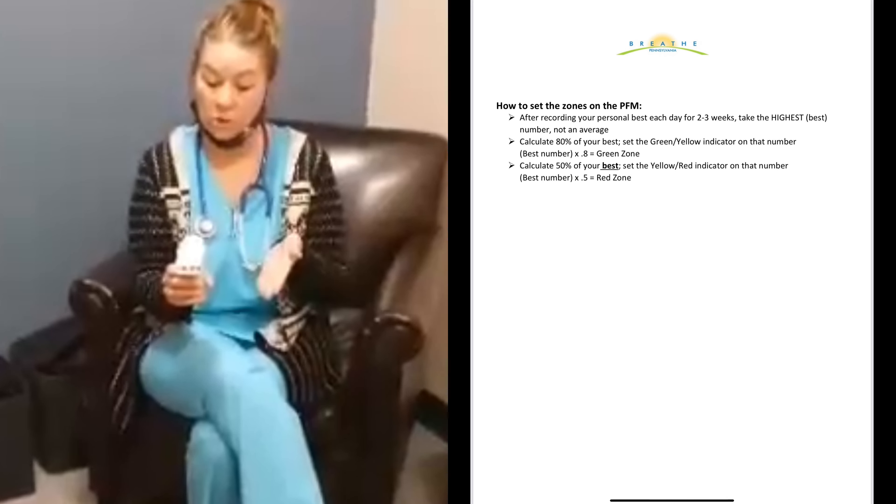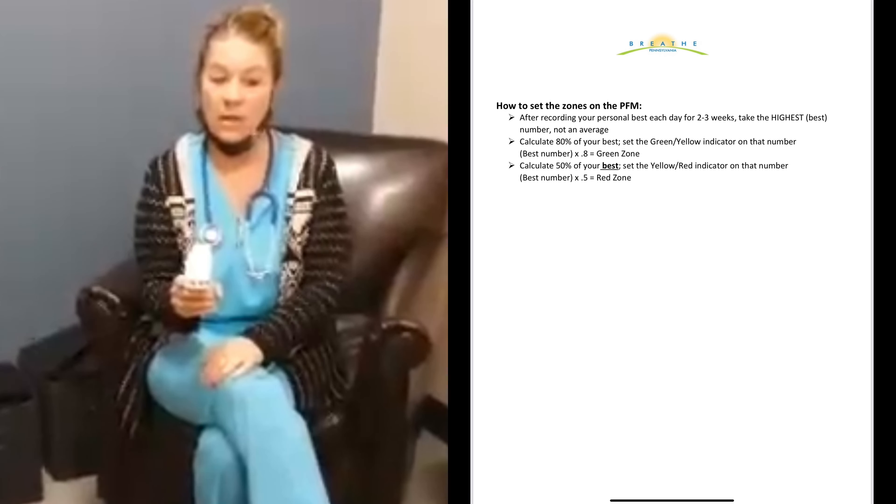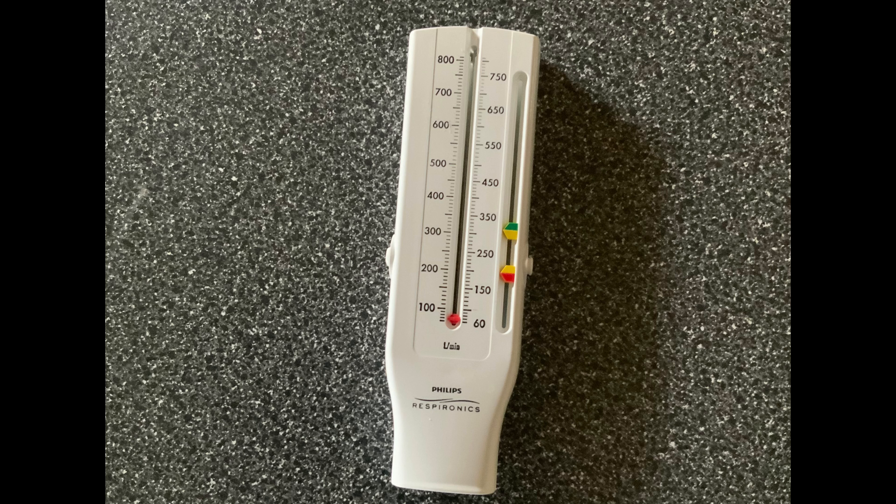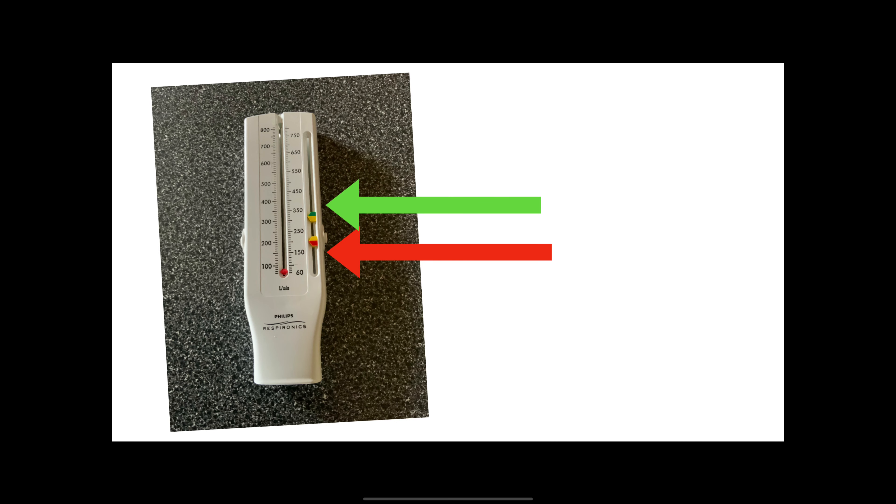Now that we've demonstrated how to properly use it, we have to show you the calculations for how you figure out if you're in trouble or not. I did mine three times and you always want to take your personal best number. My personal best was 400. So I'm going to calculate 80 percent of that, which would be 320. I'm going to move my indicator for my green and yellow up to 320, and then 50 percent of that would be 200, so I want to set my red indicator at 200.